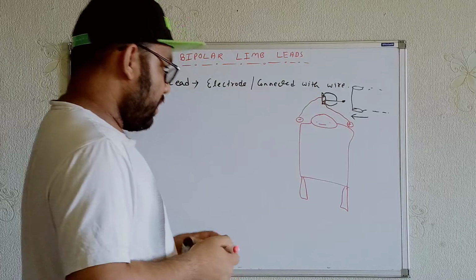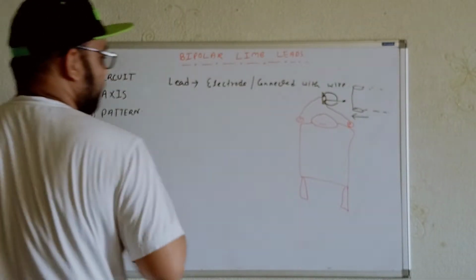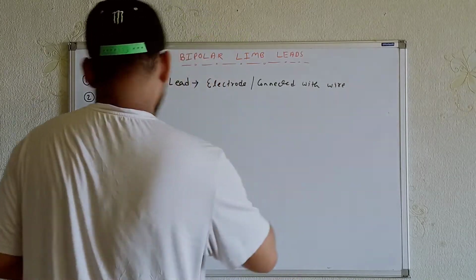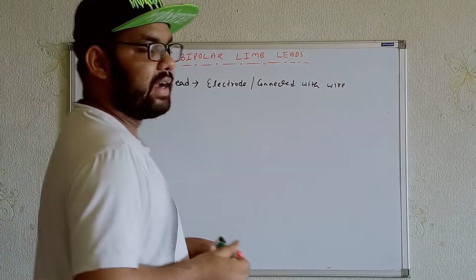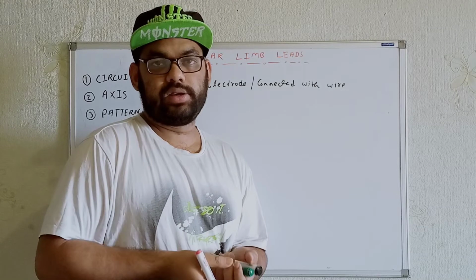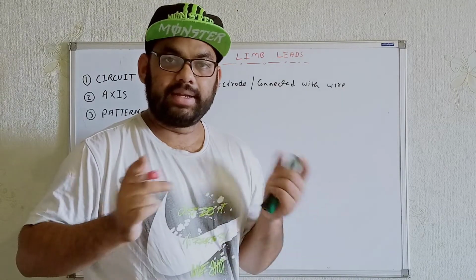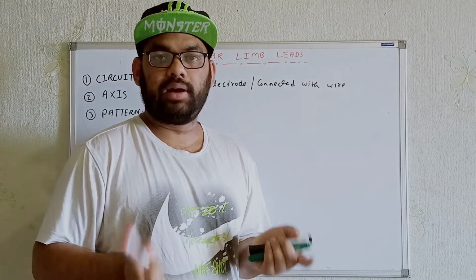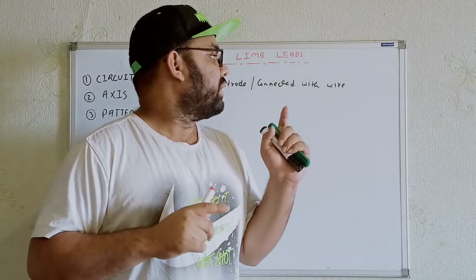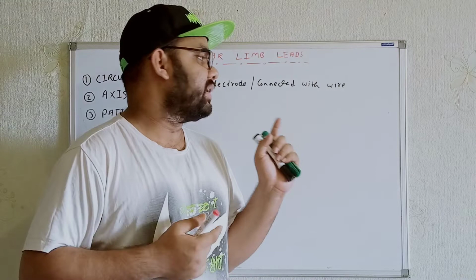Now let's talk about the function and purpose of the lead. Whenever we are seeing the different kinds of electrical activities going on in the heart, for example the atrial depolarizations, the ventricular depolarizations, or the ventricular repolarizations, whatever electrical activities are taking place within the heart will be represented as the ECG by using the galvanometer. So we can also see leads over here.